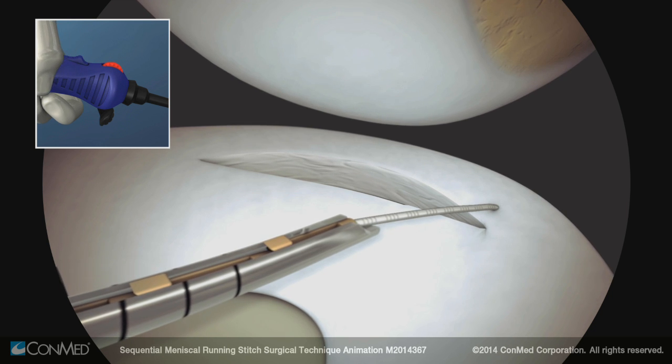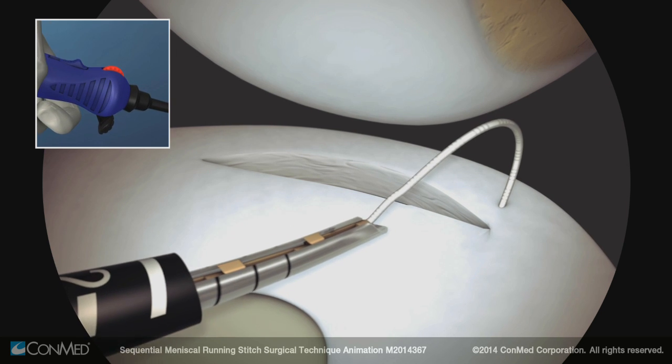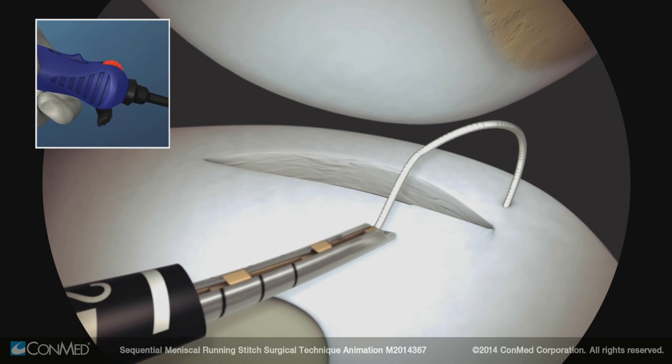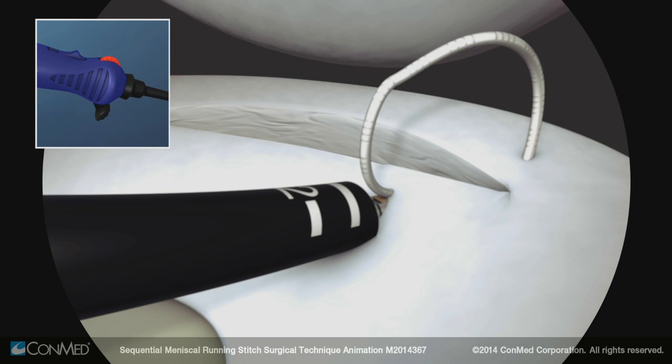Move the switch forward into the freewheel position to create slack in the suture. Target the position of the next implant on the meniscus. To place the second implant and fix the stitch, again pierce the meniscus.